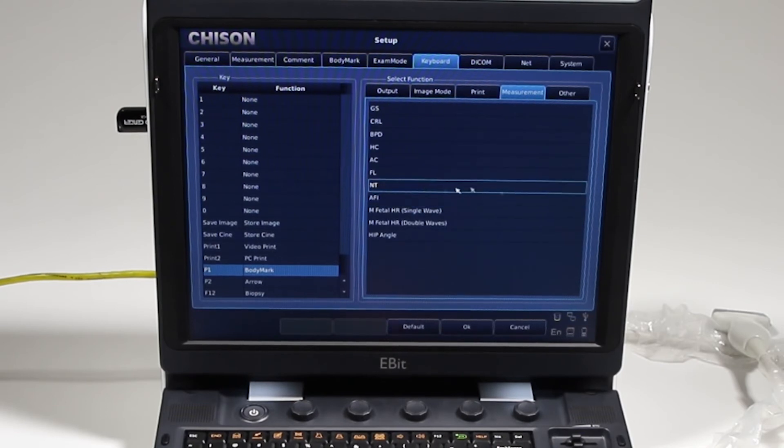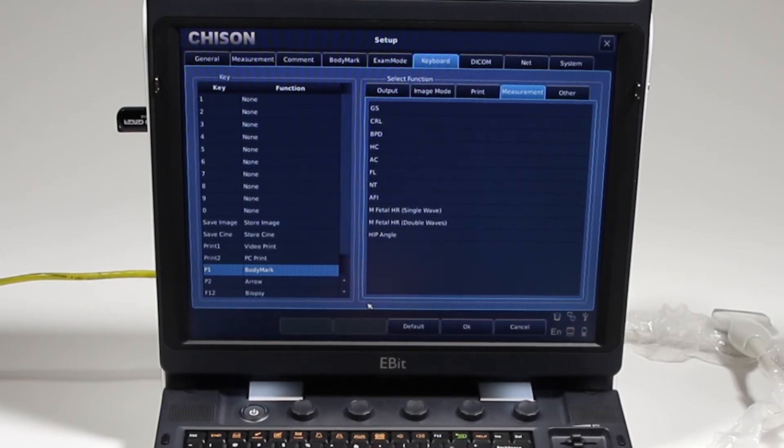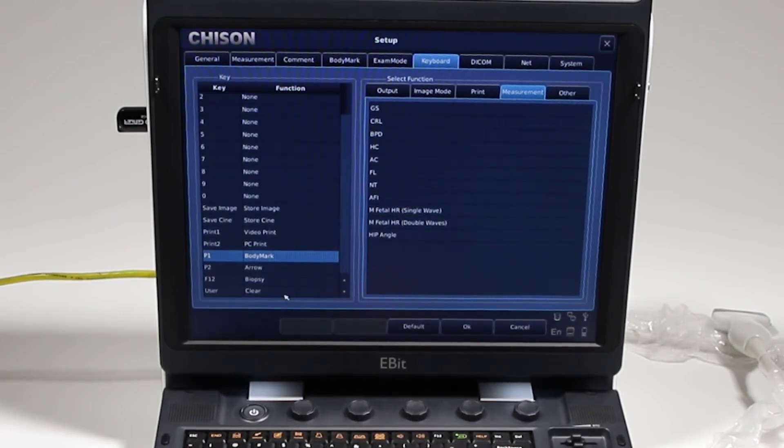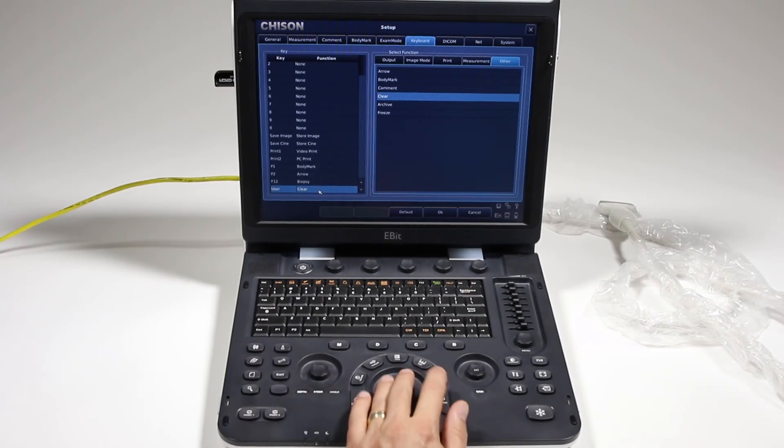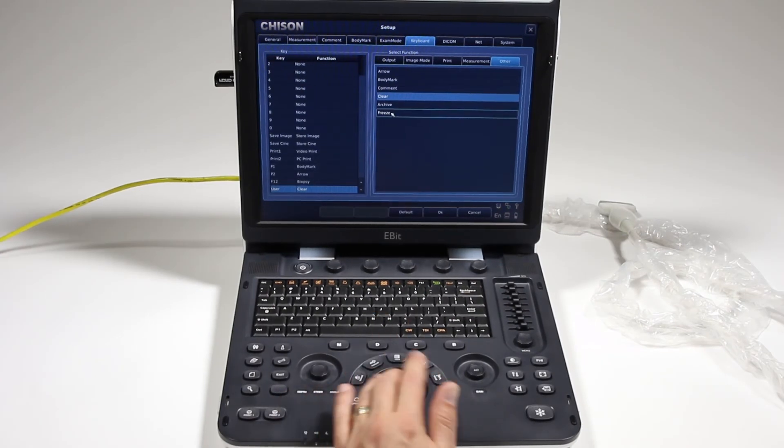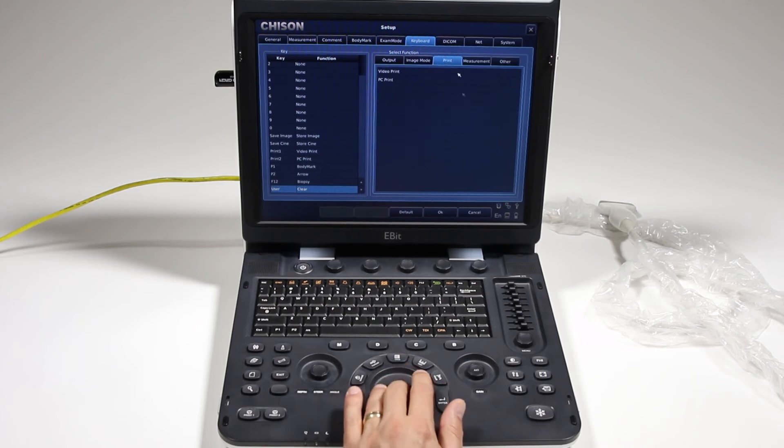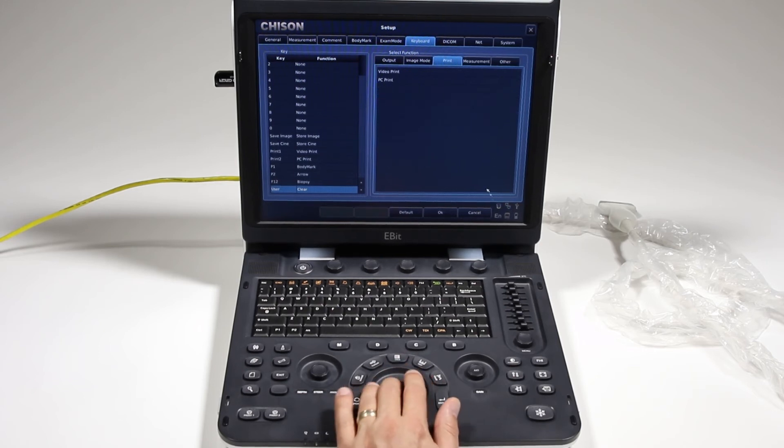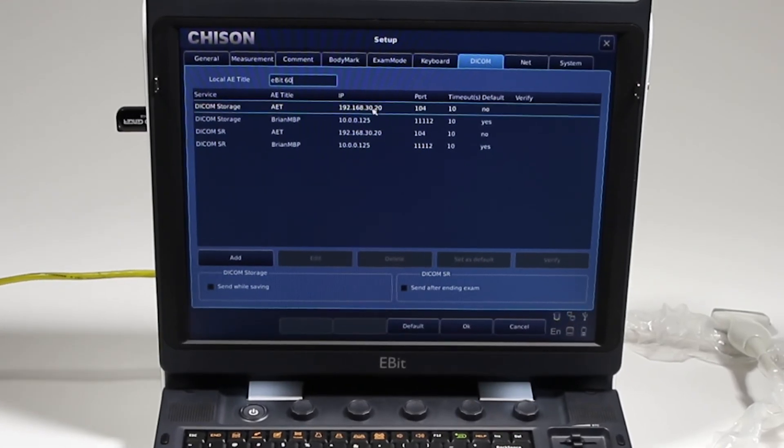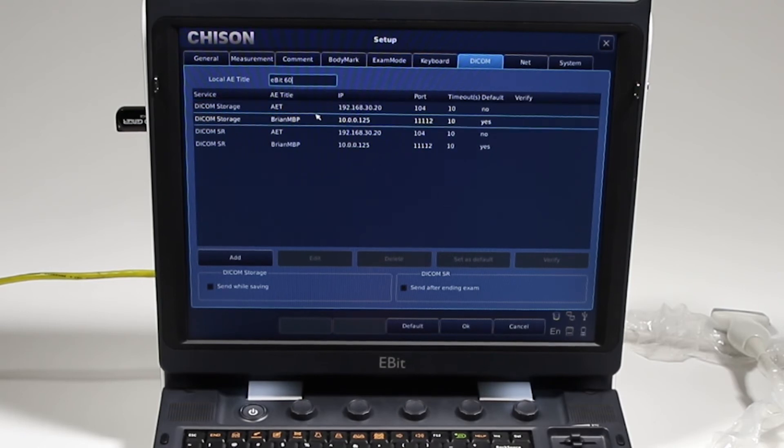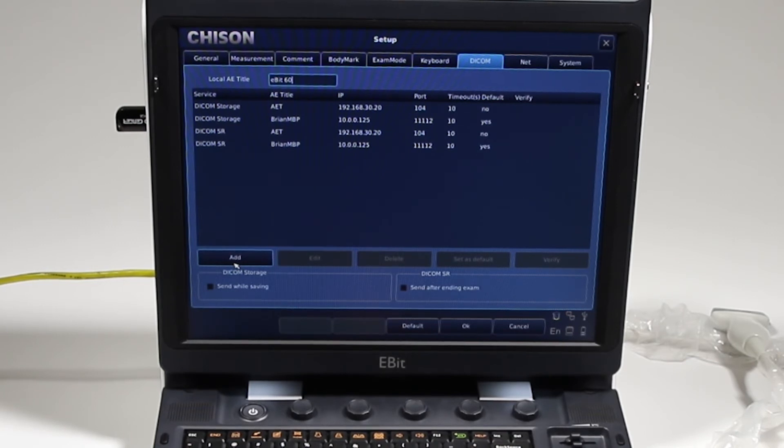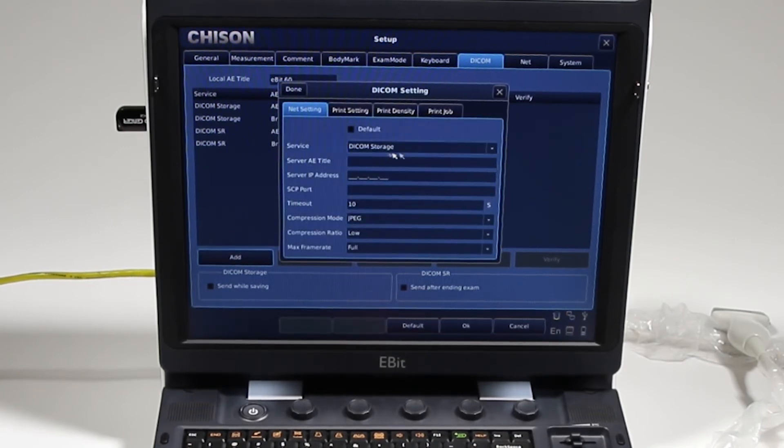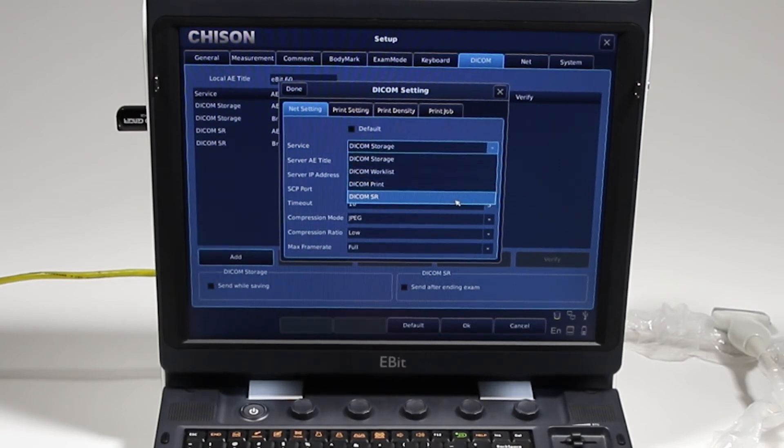These are all the functions that you can do each time you hit that. So F12 is set to biopsy right now, even though we've already got a biopsy up there. But you can set that user - that's this one that is to clear right now, but again you can get that to change to whatever you want. You can even set it as a freeze key. Okay, DICOM storage. The setup for DICOM on this system is relatively simple. You're going to just go ahead, I'm going to say I want to add a new service.